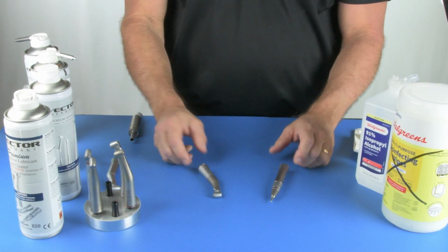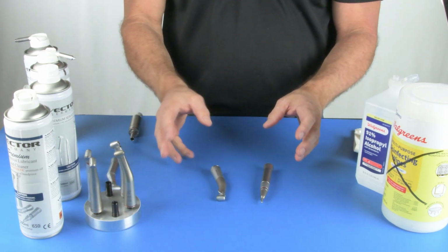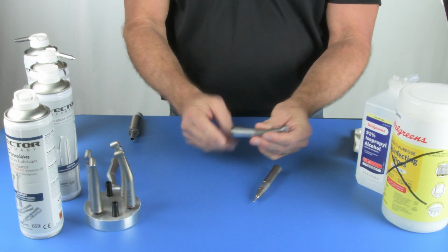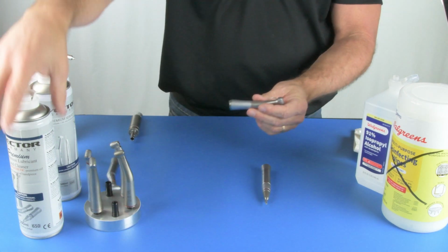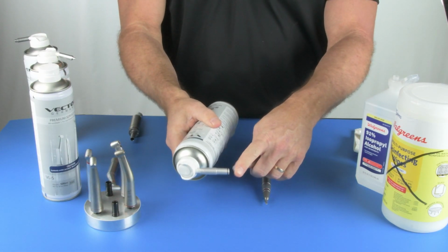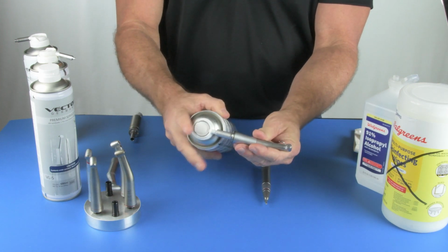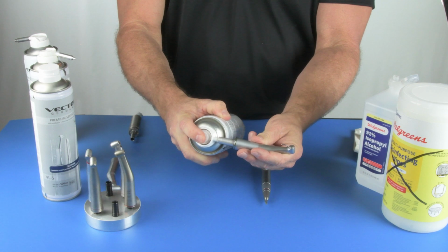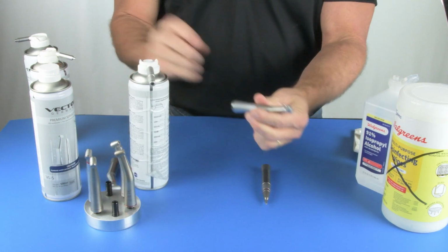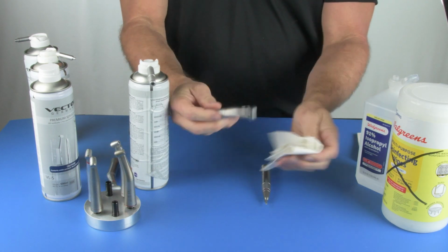Moving along, let's talk about implant and oral surgery handpieces because they do require a little bit different care. Your typical implant electric angle is going to use the same type of E-type adapter, and it's very important again that you use the correct adapter. That should fit all the way up into the handpiece before you spray it for 2 seconds. Count 1, 2. The lubricant's going to run out of the head of the handpiece. At that point, you simply take an alcohol-soaked rag and wipe off the exterior of the handpiece.